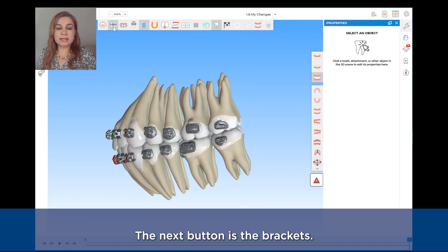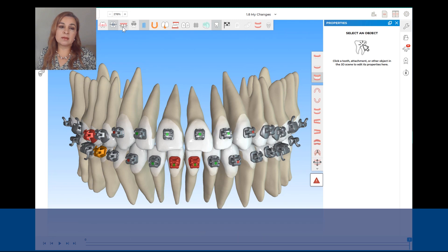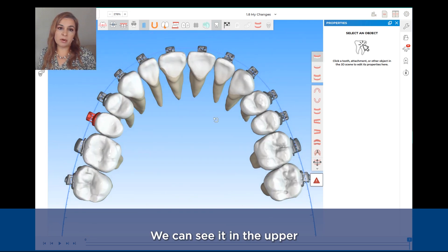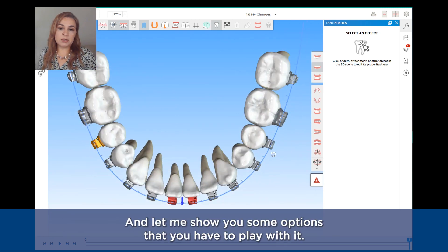The next button is the brackets — it will just toggle or show and hide the brackets. The third button is the wire plane and it is a representation of a Daemon stock wire. We can see it in the upper and in the lower as well. Let me show you some options that you have to play with it.